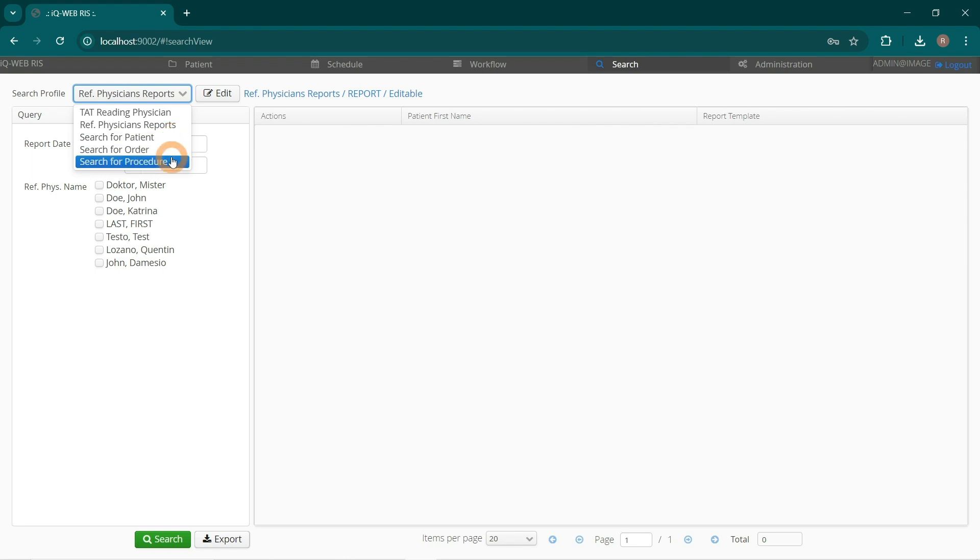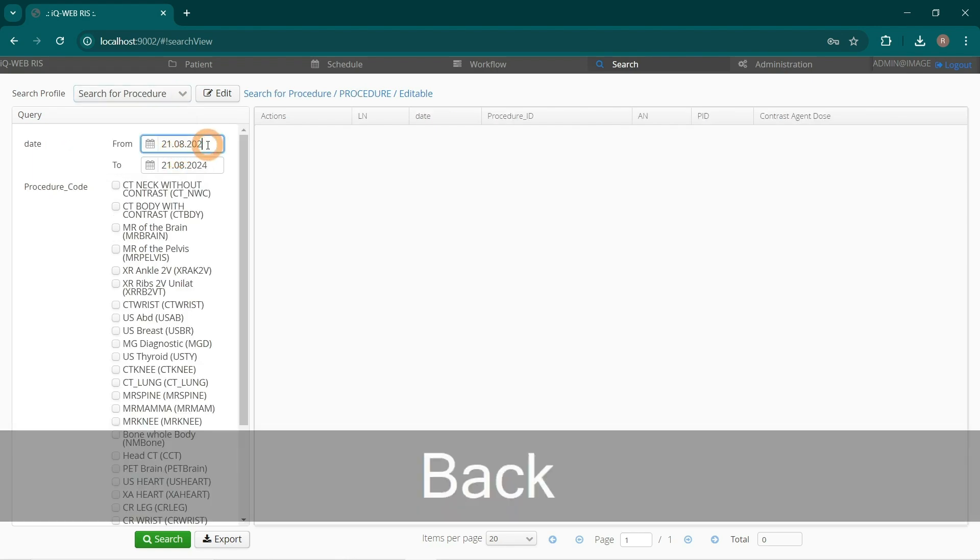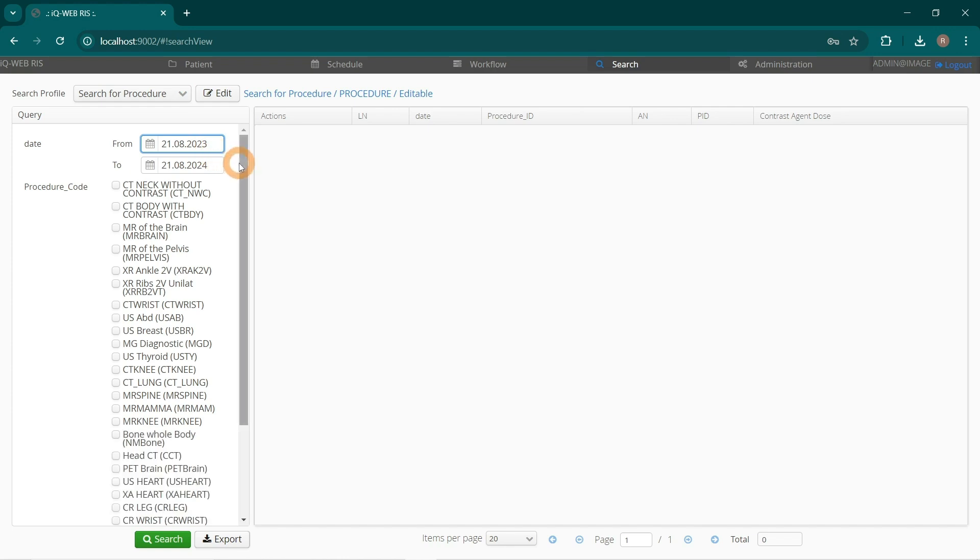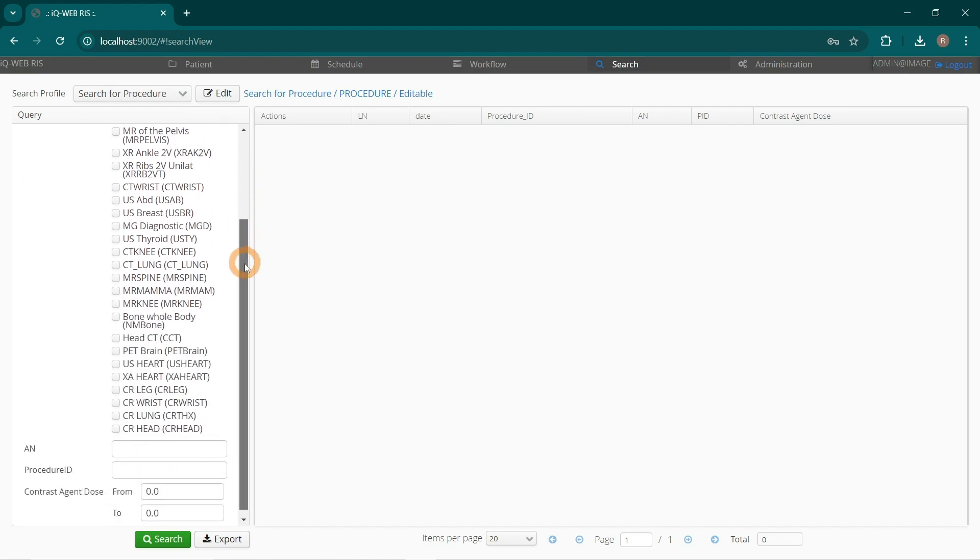Select Date Time Frame and a Contrast Agent Dose Range.